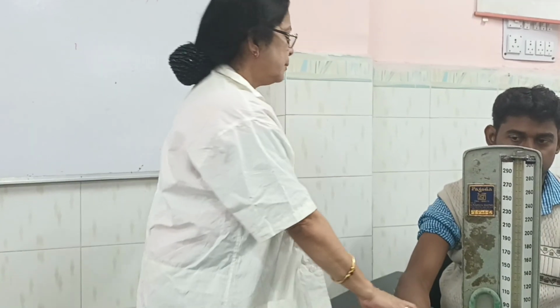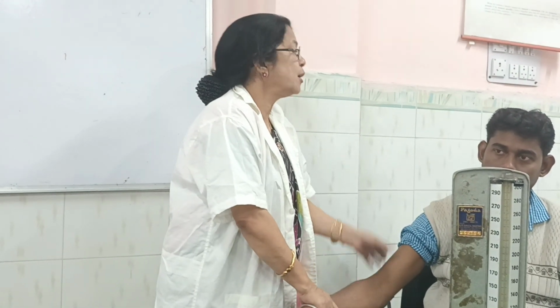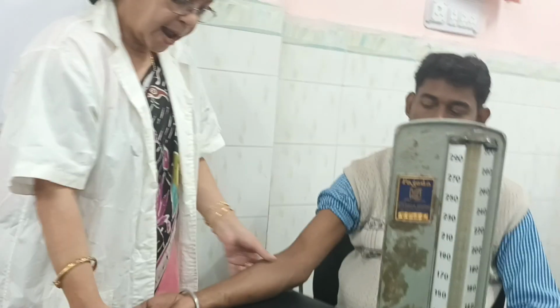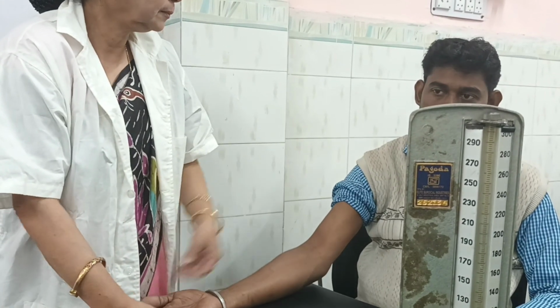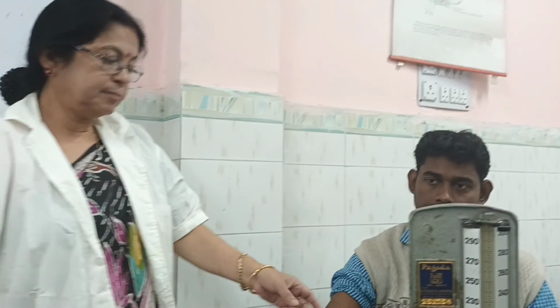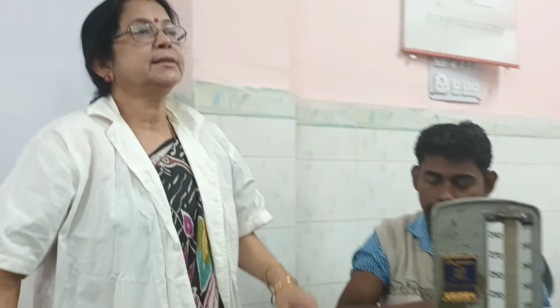Now the position of the patient, now the position of the arm. If the patient is slightly sitting or maybe supine, the arm should be slightly abducted, the forearm supinated, with the hand facing upwards. In some books, it is better to measure the blood pressure of the subject in the left arm, because the left brachial artery is a direct branch of the subclavian artery, which is a direct branch of the aorta.